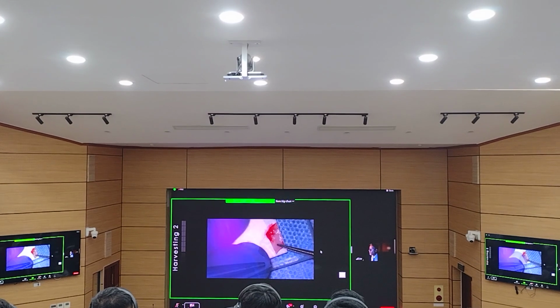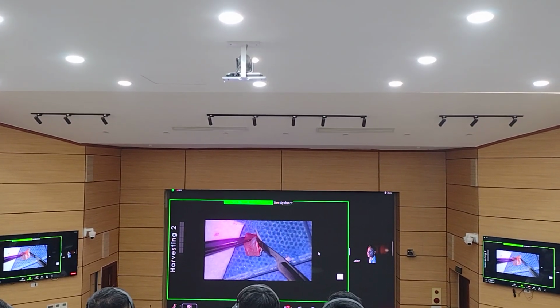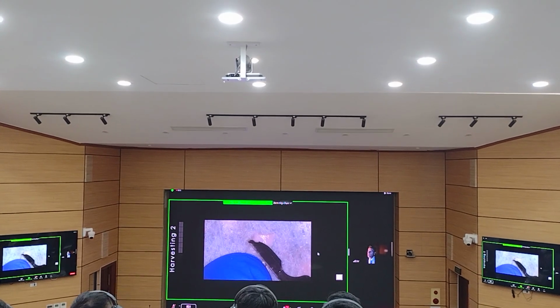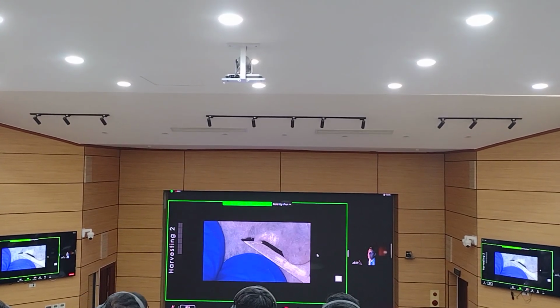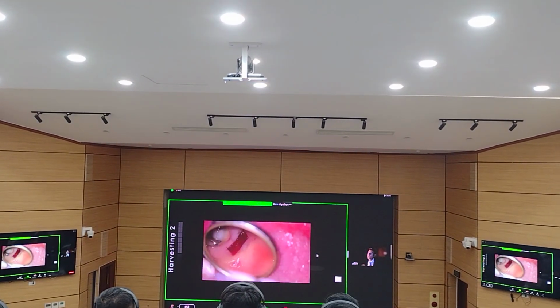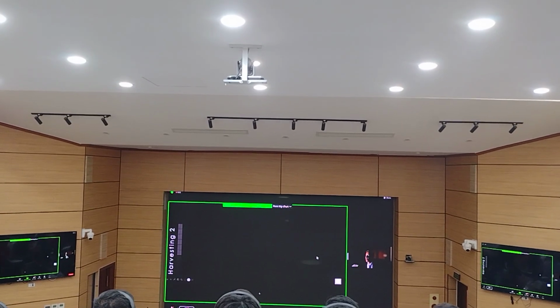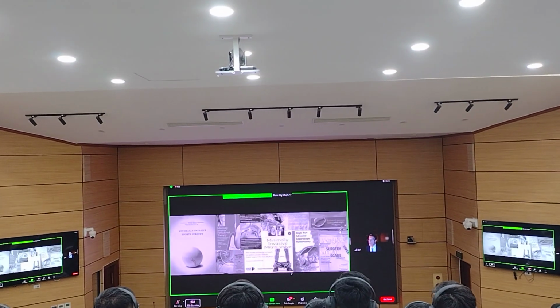And that is another way to obtain connective tissue. We're going to be utilizing some collagen in order to protect the wound that is going to be left behind, since we are removing literally a portion of that tissue. Once we remove the epithelium, then we can utilize that connective tissue. So there are a couple of ways to do that type of procedure.